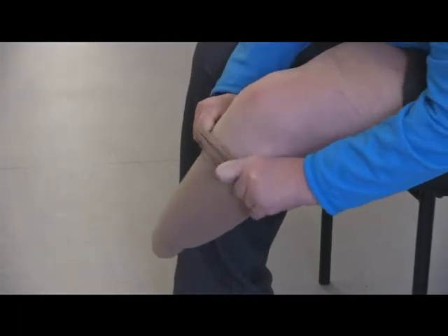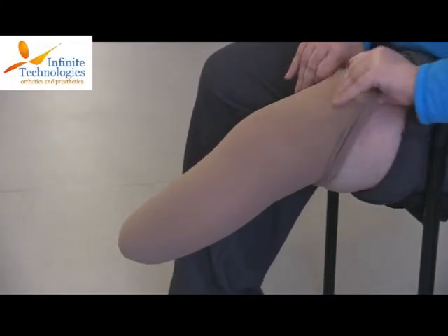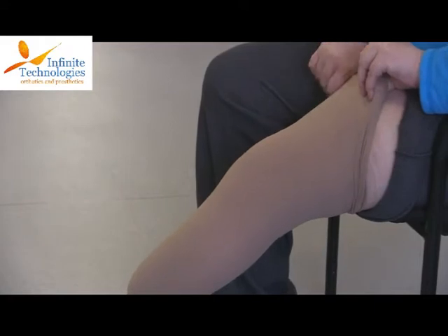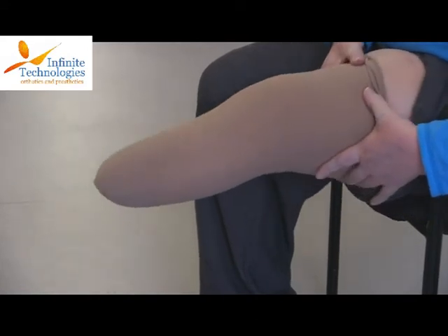In this video, our model will demonstrate how to apply a below-the-knee shrinker. As the shrinker is applied over her limb, she bunches up the shrinker prior to application. This enables the shrinker to be easily pulled all the way up, and also ensures that there are no wrinkles or excess material on the distal end of her limb.